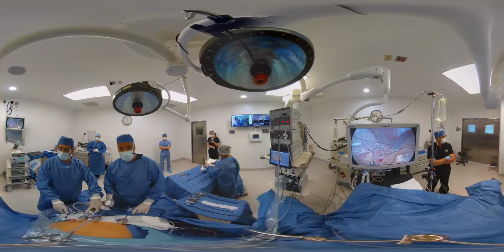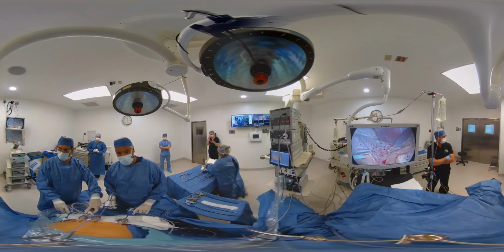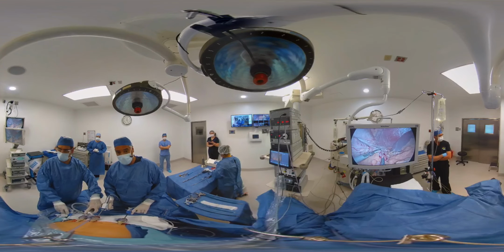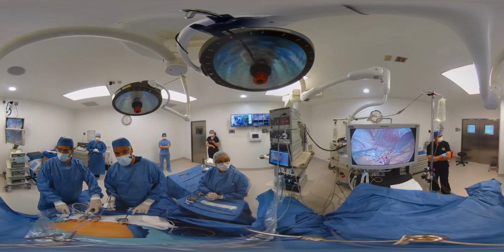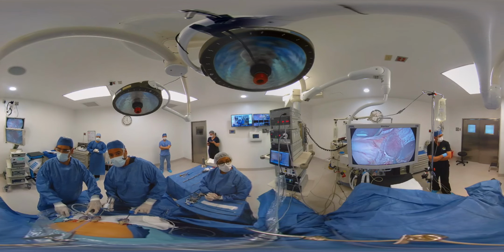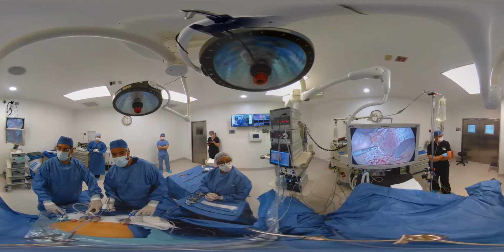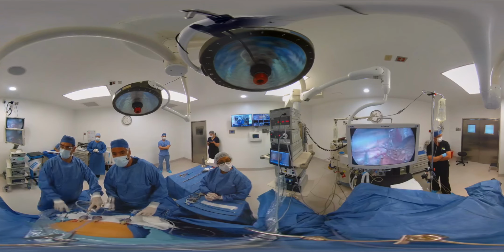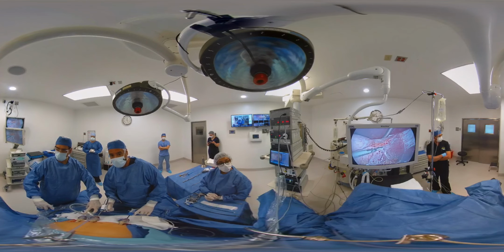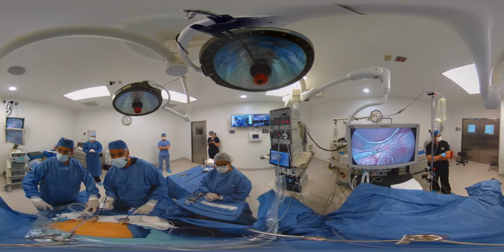So what we're doing first in this surgery is, well, in modern surgery we use high-end technology. In this case we're using a vibrating device which acts as a cutting and cauterizing instrument. In fact, it vibrates over 55,000 times per second, which separates the molecules. This is basically called ultrasonic dissection.